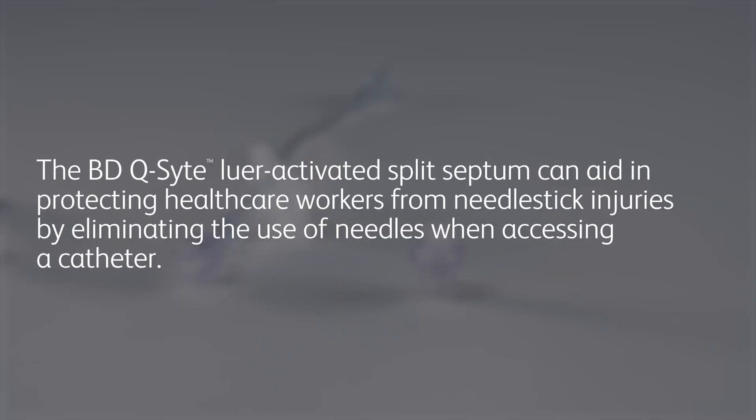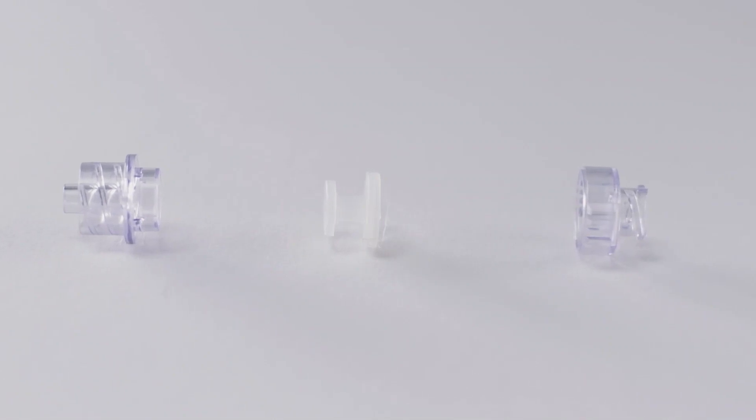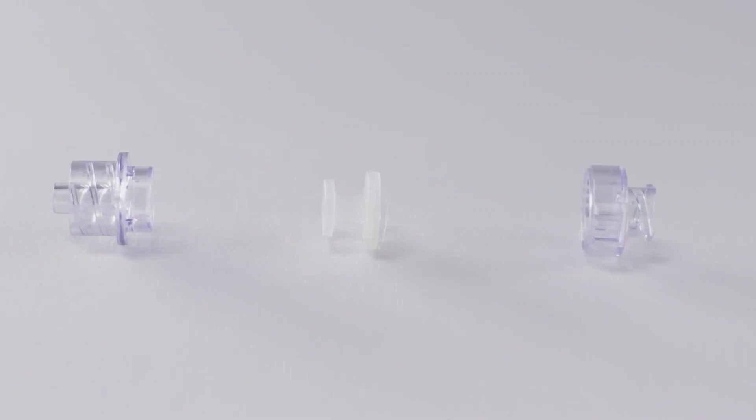As a needle-free connector, the BD Q-Site lure-activated split septum can aid in protecting healthcare workers from needle stick injuries by eliminating the use of needles when accessing a catheter. Additionally, the BD Q-Site lure-activated split septum provides a fluid path with no internal mechanism and a clear housing that allows you to view and assess the fluid path.